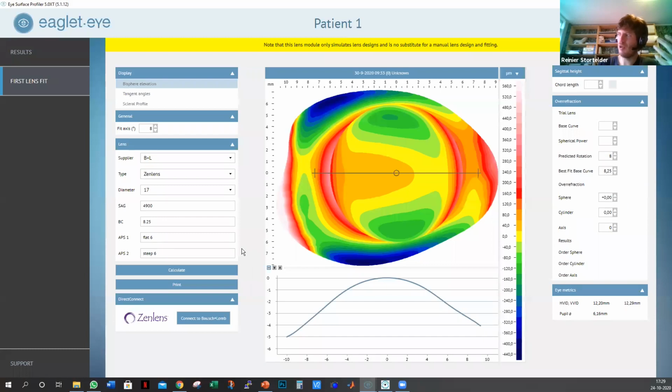That means that we can always offer you the latest algorithms, even when you are behind on software updates or for whatever reason, or if there was a bug. So we always have the algorithms in the cloud to offer you the latest algorithms. After 30 seconds, you get 4 values back.